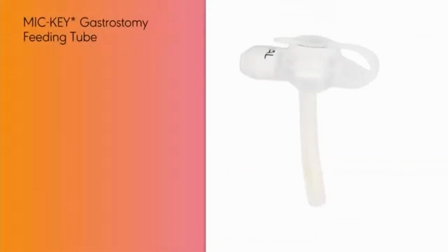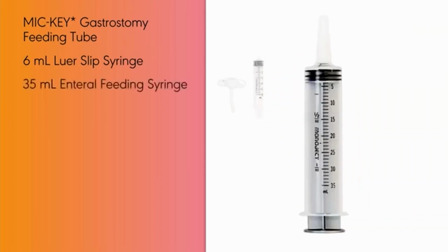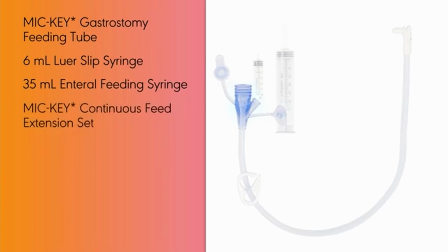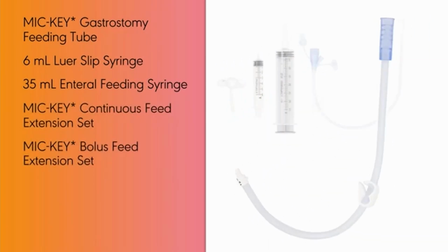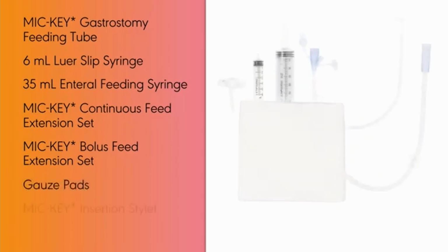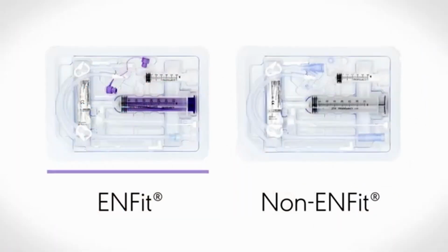The kit contains the MIC KEY Gastrostomy Feeding Tube, a 6 milliliter luer slip syringe, a 35 milliliter enteral feeding syringe, the MIC KEY Continuous Feed Extension Set, the MIC KEY Bolus Feed Extension Set, gauze pads, the MIC KEY Insertion Stylet, and water-soluble lubricant. The kit is available in both an ENFit and a non-ENFit version.